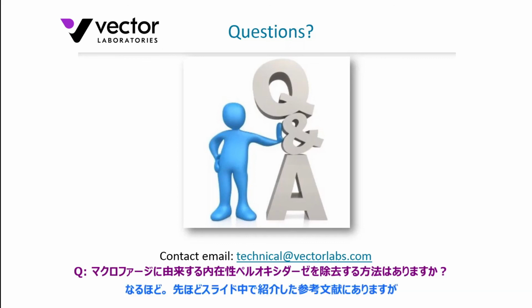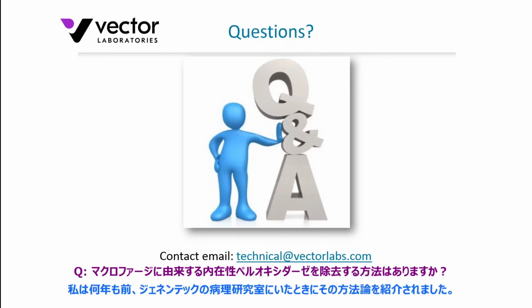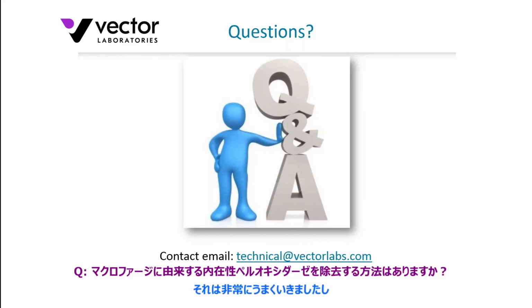Yeah, fair enough. And the reference I did mention earlier, which was on the slide earlier, does mention the use of glucose oxidase, glucose and sodium azide, and that is very effective. Believe it or not, I was introduced to that methodology many years ago when I was at Genentech working in the path lab there. So it did work very well for them, and I've found it to be a very superior methodology and gentle over something such as hydrogen peroxide.